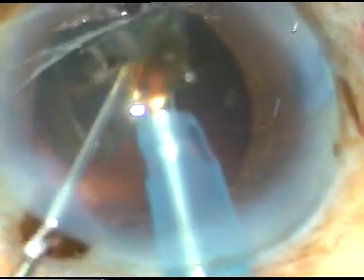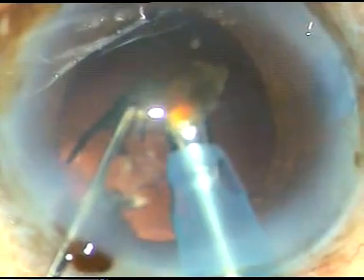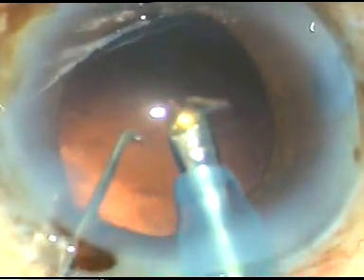At this time I am at iris plane. I ask my assistants to come down to Phaco On mode where the phaco power is 95%, flow rate is 25, and vacuum is only 80. Yes — with very low vacuum I can emulsify and remove these last pieces. Now I gently come out and reposition the iris.